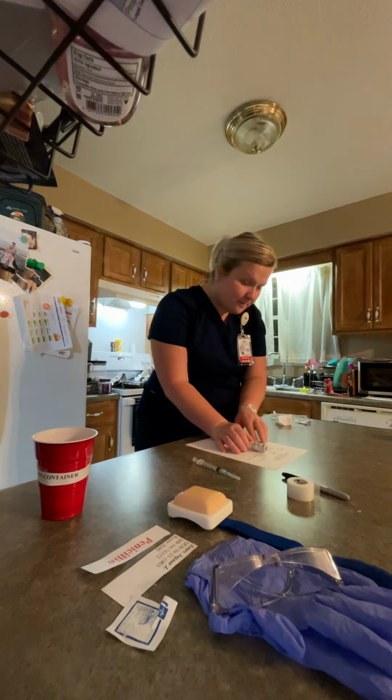Every 4 hours, PRN, so PRN means as needed, and it has been 4 hours and Mr. Jones is asking for his pain medication. This is an IM injection, which is intramuscular, which is why I have a 23 gauge needle, and it is a pain medication. The right indication for this medication would be for pain, and the right documentation, I would document anything up until this point.